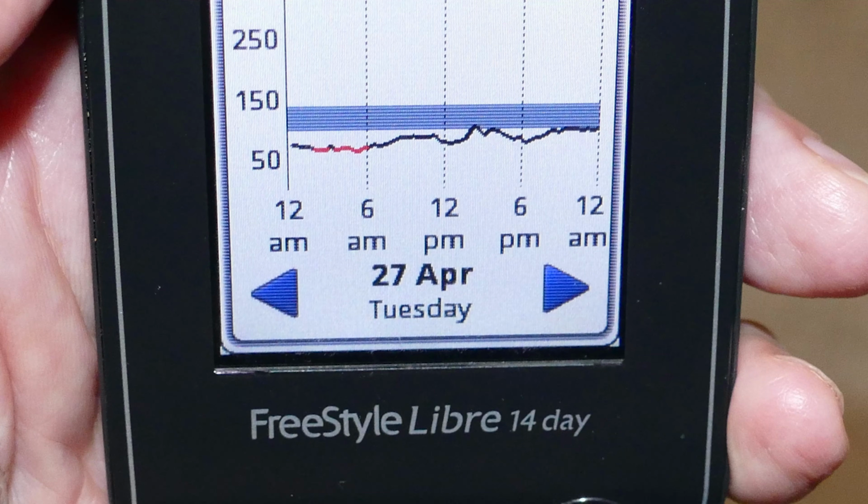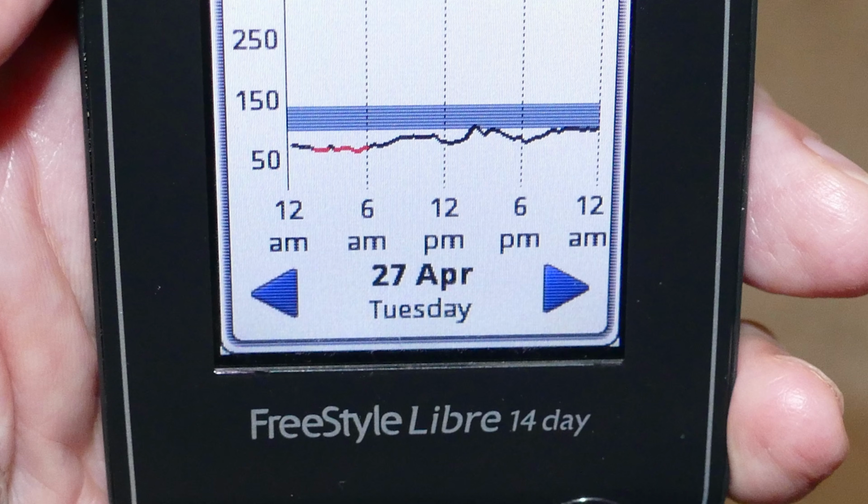And in fact, around 12 p.m., it dips a little bit and then goes up. Now, one thing I need to say is that I normally have late lunches, and because my breakfast usually is fairly late, although on the days that I'm coming off a fast, I would probably eat a lot sooner. But somehow on Tuesday, there was really no spike at all to speak of, just a slight drifting upward in the morning. Finally, it starts to hit the 100 mark, probably around 2 p.m., and hangs out there for an hour or a little more, and then starts to dip down once again.